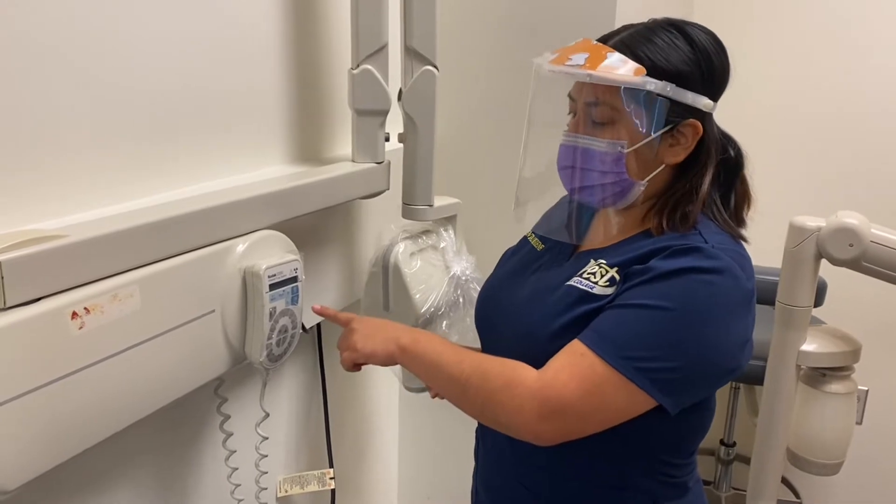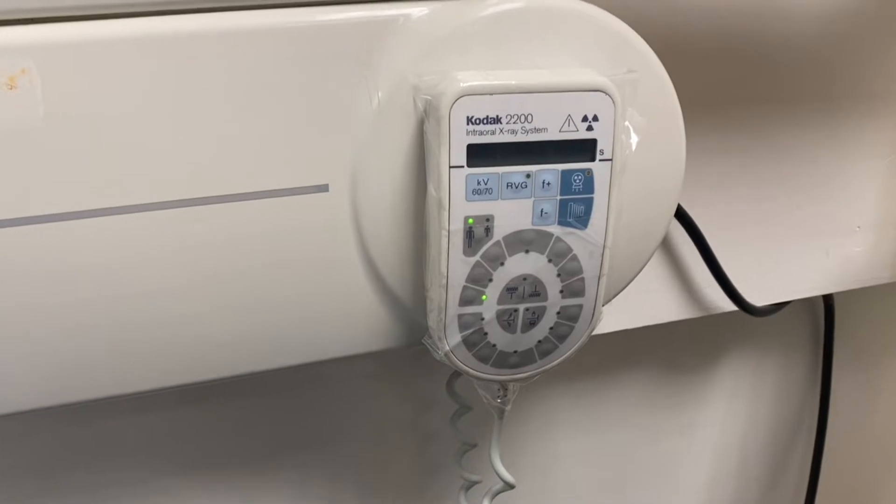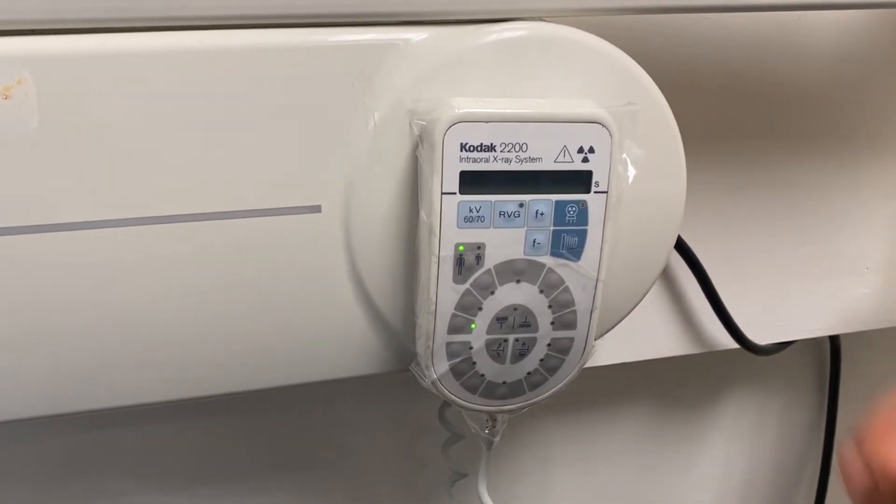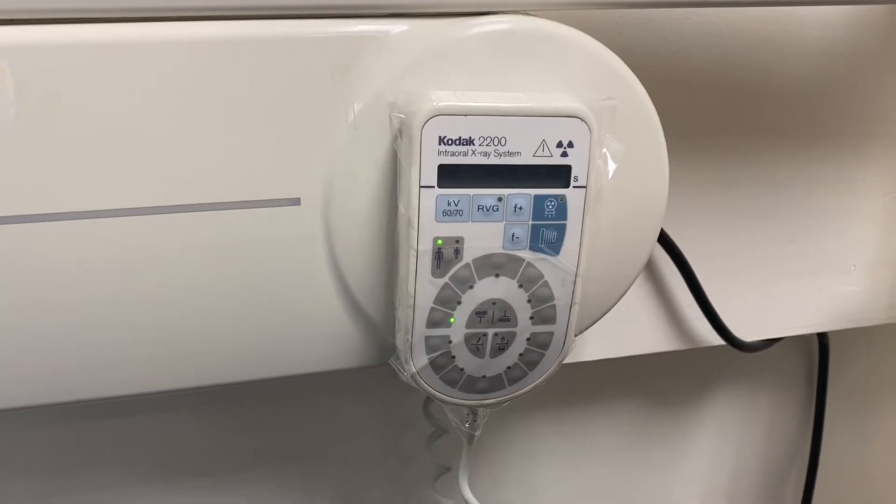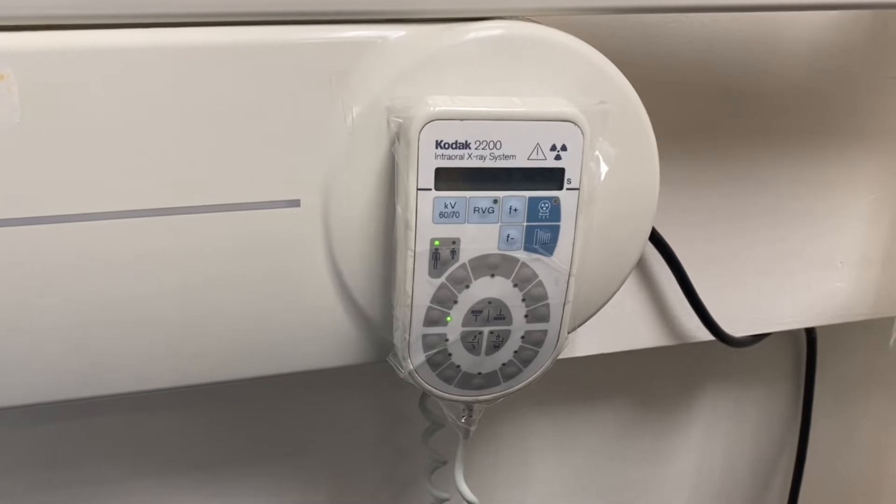From there, our setting needs to be set to a traditional setting, not the digital. In order to determine that, we have to look at the RVG light. The light will be on if it's on digital or it will be off if it's on traditional, just like how we want it here in traditional.